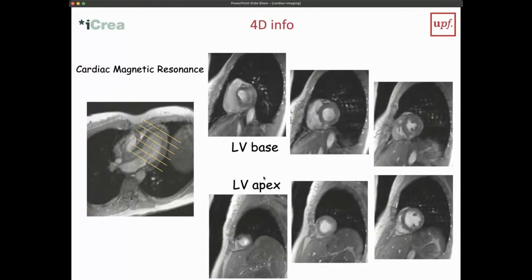And then, of course, only at a temporal resolution which is in the order of the variability of the heart rate, because we cannot time it better. But still, this is quite useful to look at some motion. The big advantage compared to echocardiography is that we really have full resolution 3D or 4D images, if we take time as the fourth dimension.